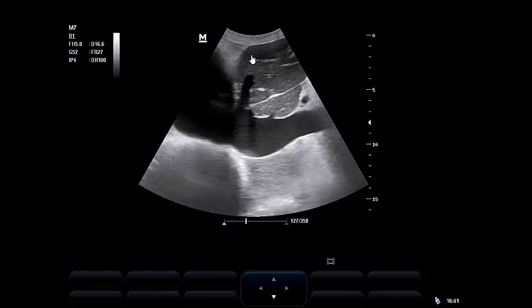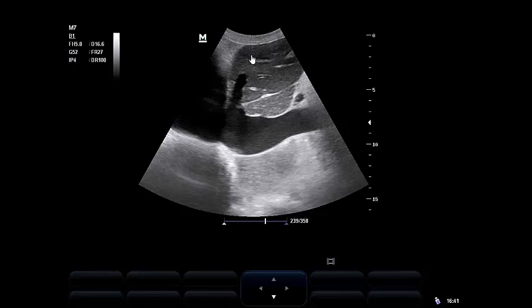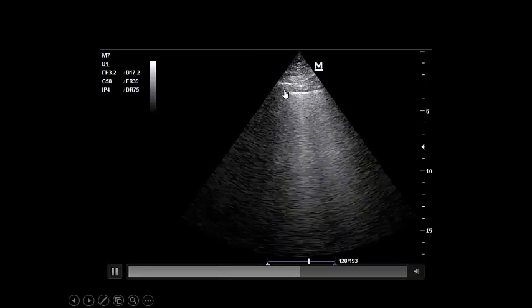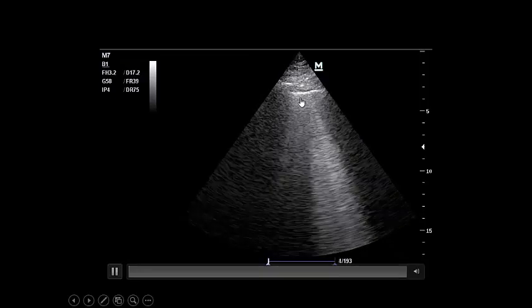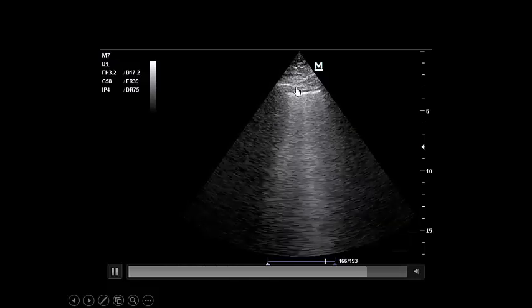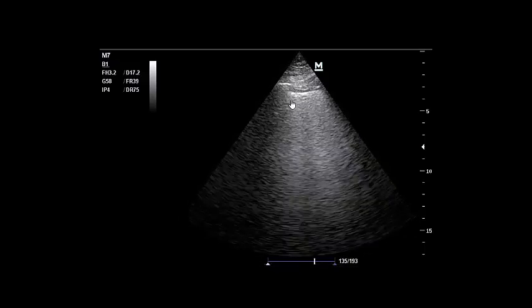and your patient is severely distressed and hypoxic, please look at the lung. As you see here, you are targeted. Look at B-lines. If you see homogeneous B-line with thin pleura, like this patient, thin pleura, homogeneous B-line, and no A-line in the field, and no subpleural consolidation, you are talking about cardiogenic pulmonary edema.